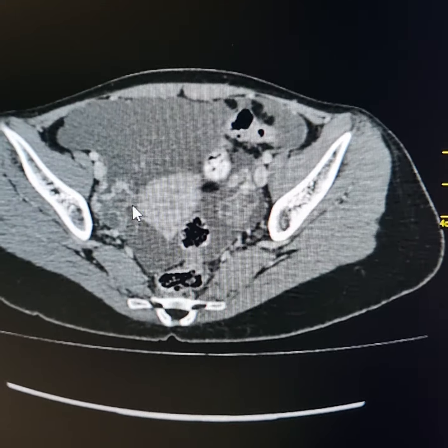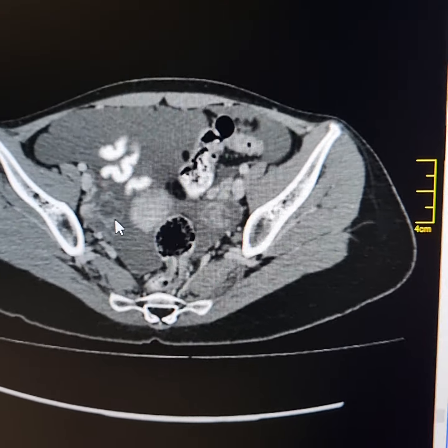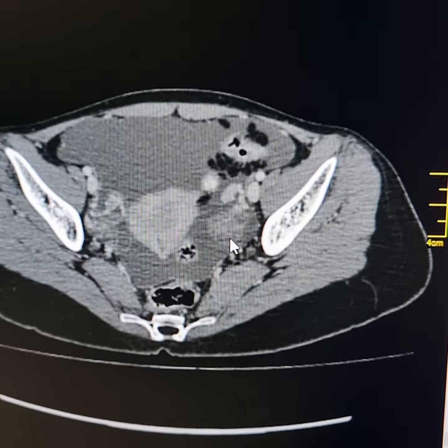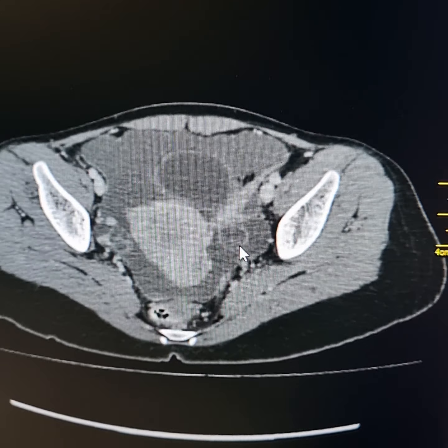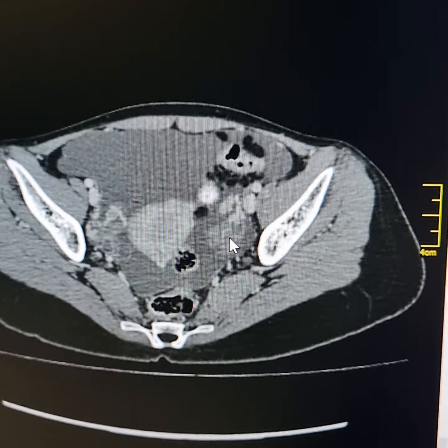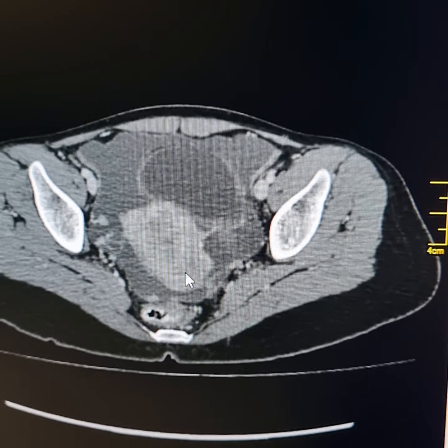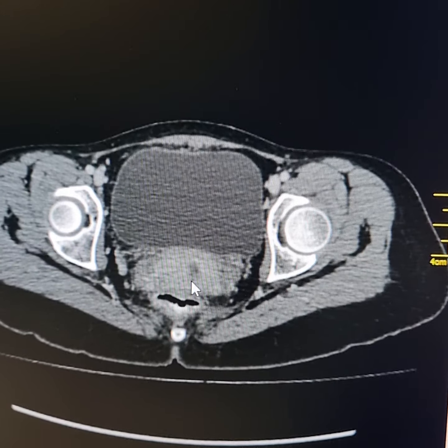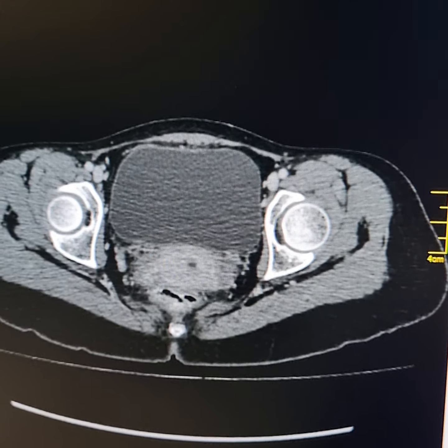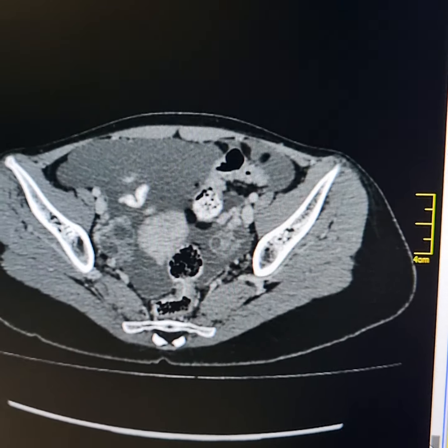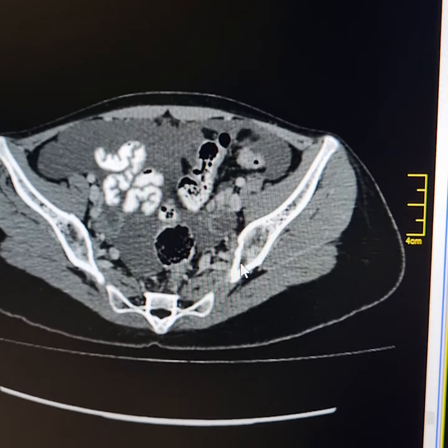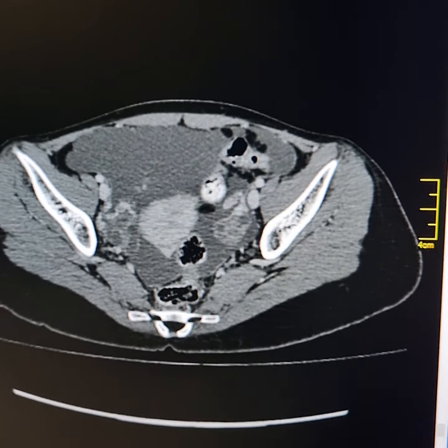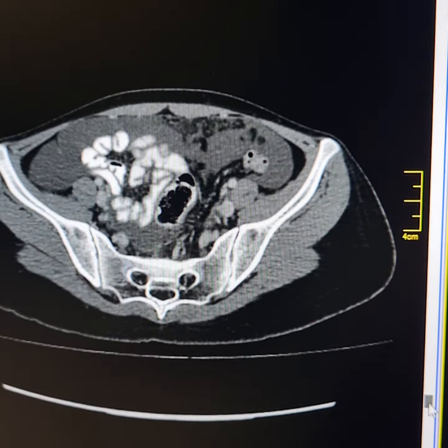This is the right ovary. The volume of the right ovary was approximately 19 ml. Multiple small cysts are noted in it. This is the left ovary; this is also prominent. Its volume was approximately 18 ml. Small cysts are noted in it. The uterus contained a few small intramural fibroids. So both the ovaries are slightly enlarged, containing multiple small cysts. The likelihood is that these are metastatic lesions or Krukenberg tumors.